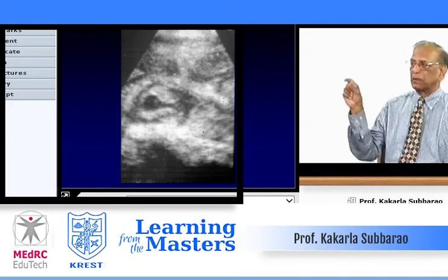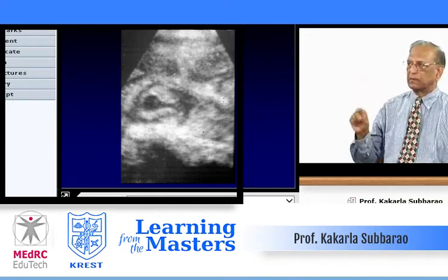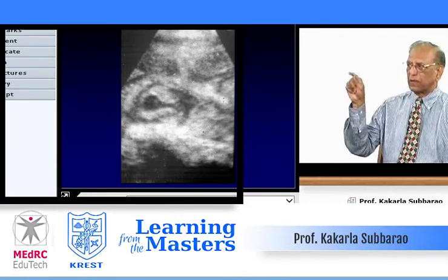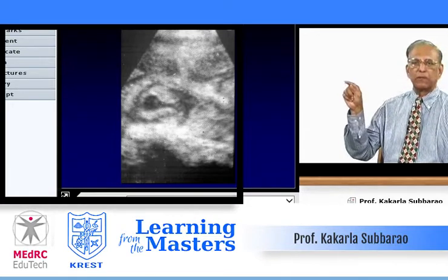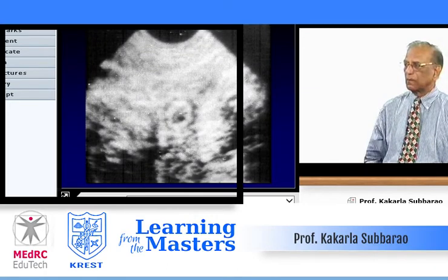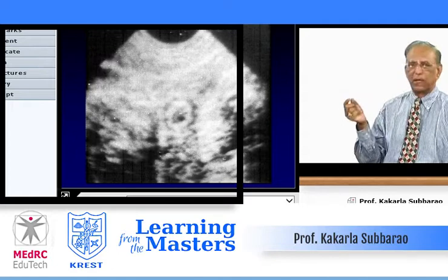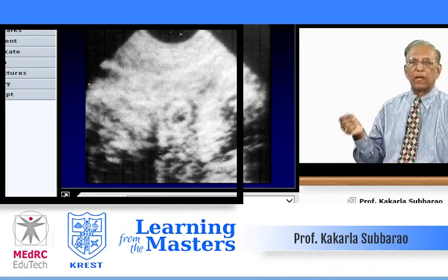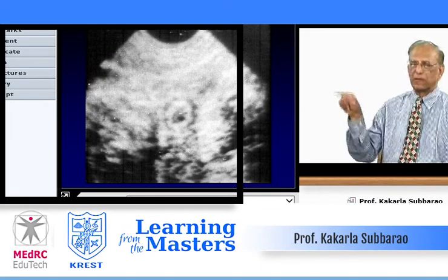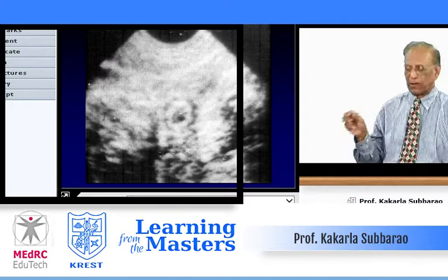Look at this. A big edema-like curvilinear lesion, and surrounding that is the edema, the inflamed appendix. It is end on. We are talking about a target lesion. Look at the lumen and the thickened wall, and surrounding it is edema. The non-echogenic area is edema; the echogenic area is the inflamed appendicular wall.